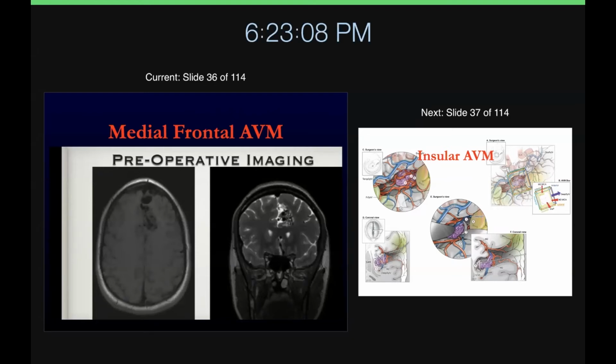And you see I'm going to go into a little bit of the brain over the top. And as I go in there, what you see is that this trajectory really helps. This is the edge of the AVM here, and we're going to go in right over the top. And because I'm kind of peering over the edge, you see how I'm able to see around the AVM. This is the border right in here.